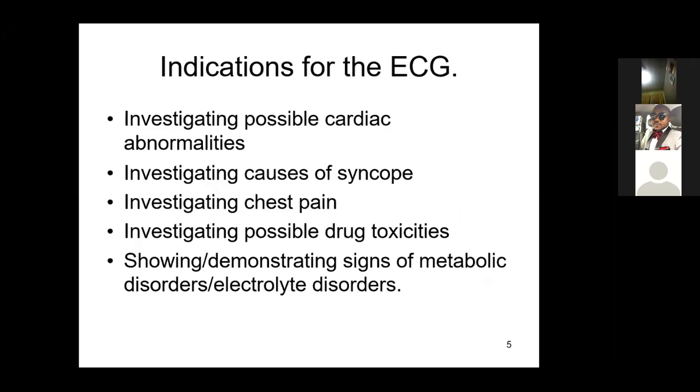Brief indications for the ECG or electrocardiogram: investigating possible cardiac abnormalities, investigating causes of syncope, investigating chest pain, investigating possible drug toxicities, and finally showing or demonstrating signs of metabolic disorders and electrolyte disorders.